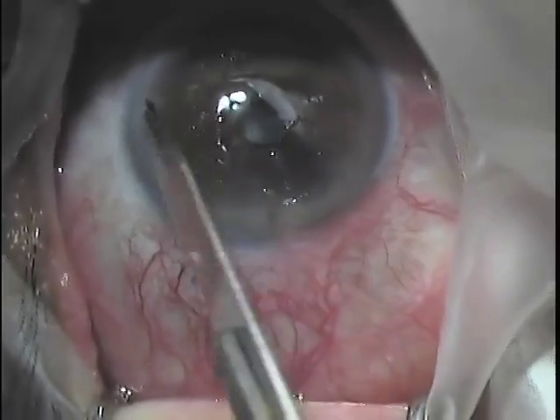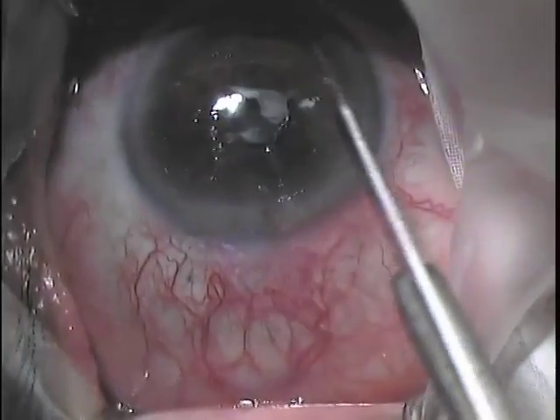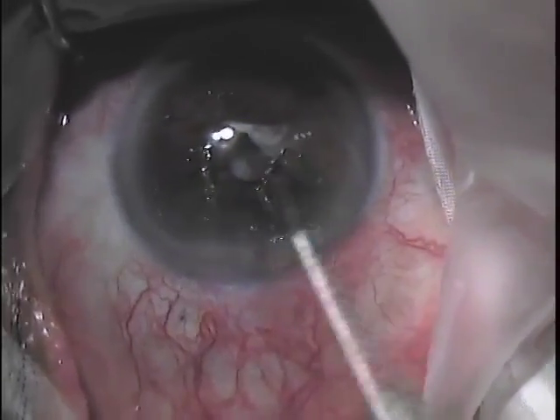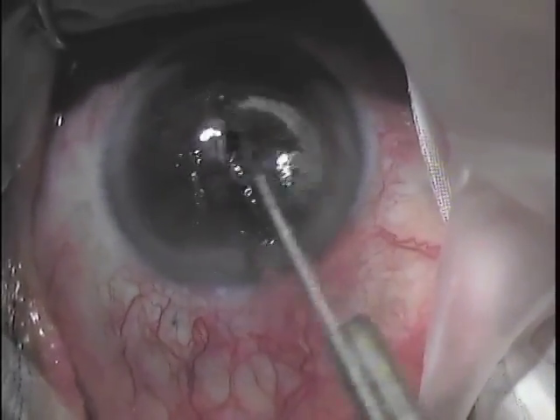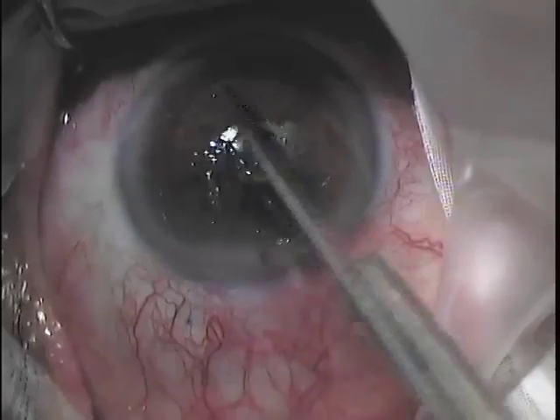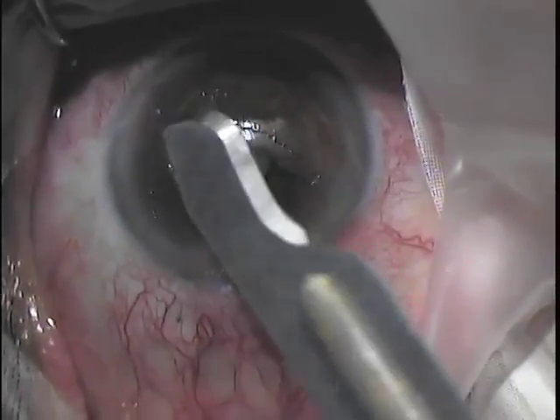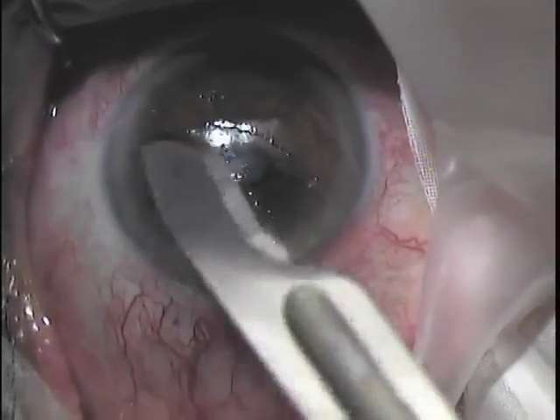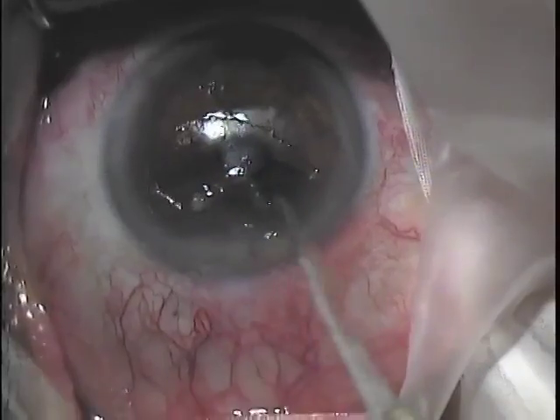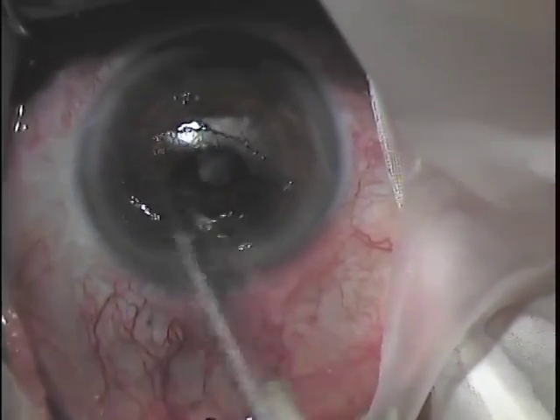A bandage contact lens had been used for a number of weeks. In this step, we're using the side of a 15 blade to slightly roughen the edges and do slight debriding of epithelium surrounding the non-healing defect in this eye.